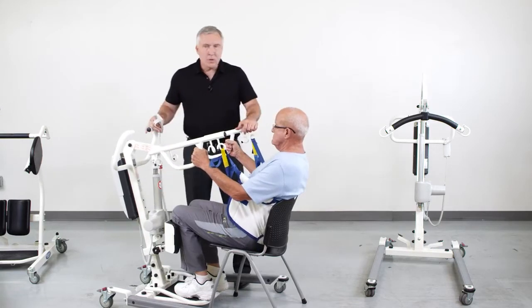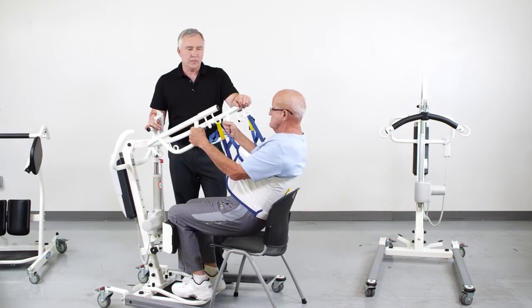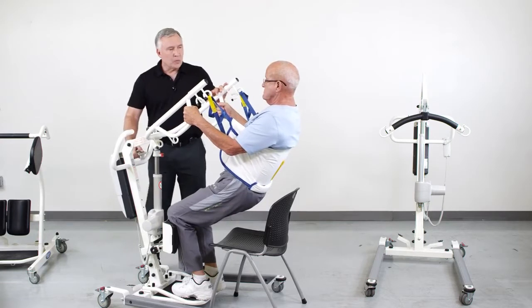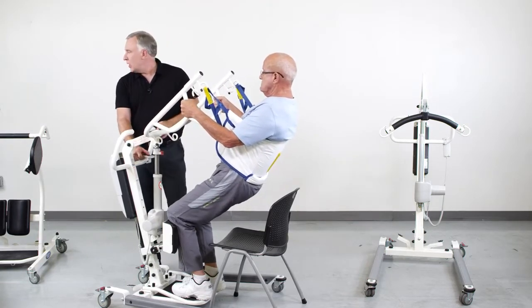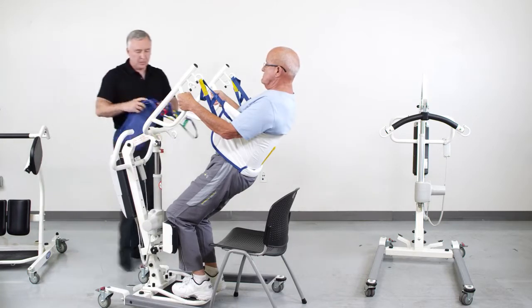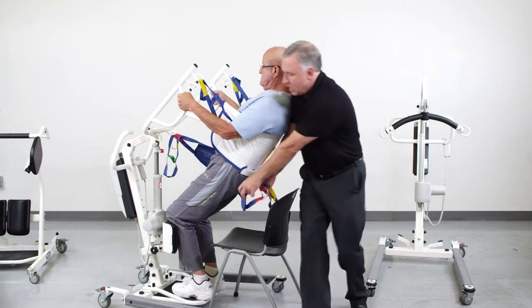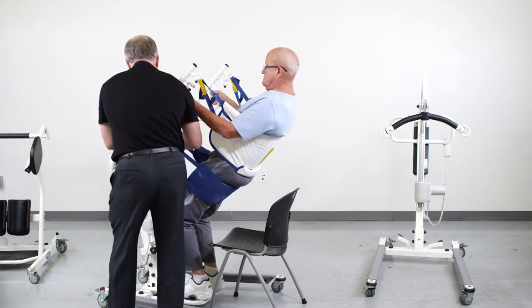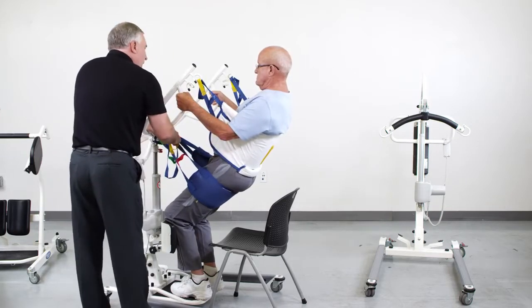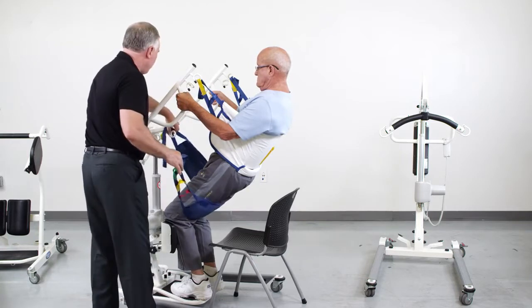And over time, of course, the patient can start to lose their ability to even hold themselves upright into a standing position. When that happens, we grab our support strap and we can wrap that underneath the patient and support them. And if a patient even requires further help, then we go on to using our Sling to give that patient complete support.